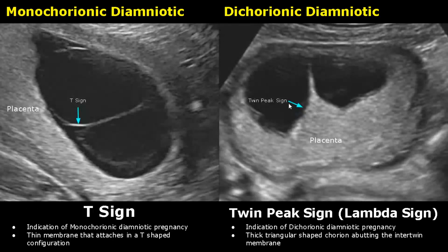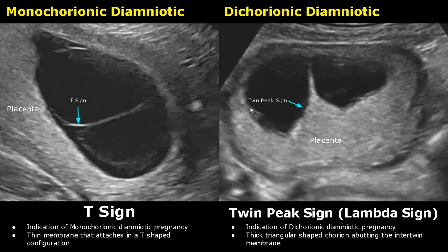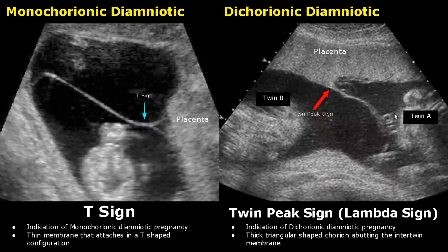The T-sign is an indication of monochorionic-diamniotic pregnancy. This thin membrane attaches in a T-shaped configuration. The twin peak sign, also known as the lambda sign, is an indication of dichorionic-diamniotic pregnancy. A thick triangular-shaped chorion will be seen abutting the intertwin membrane. Here are more images — this is the T-sign and this is the twin peak sign, where the triangular-shaped chorion is seen.